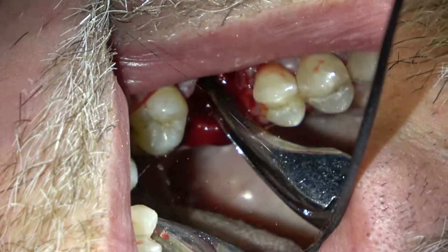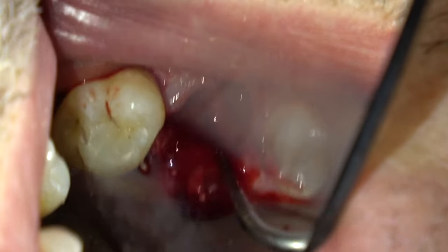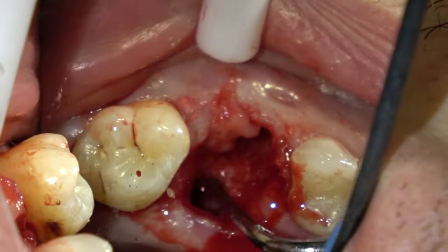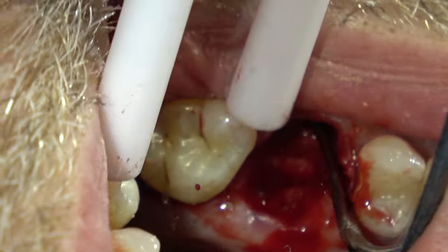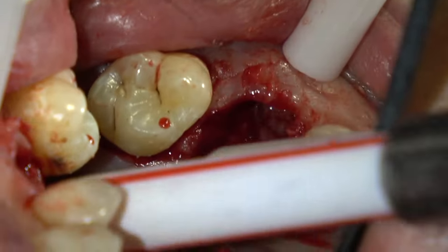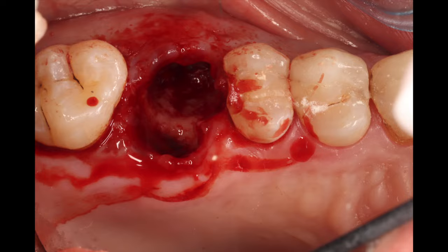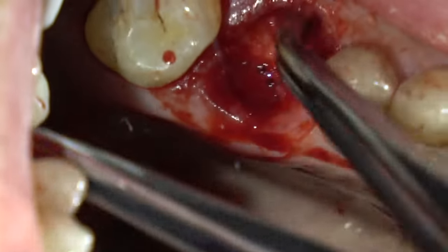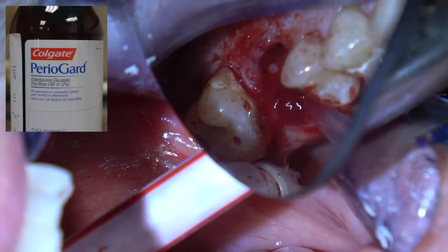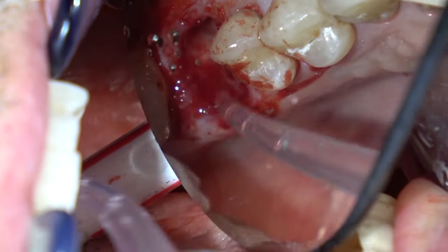There's a lot of granulation tissue in here because we had an infected tooth. I'm going to remove as much as I can with the rongeurs and come back with a large spoon curette to scrape the granulation tissue out of those sockets. If the roots of the tooth are into the sinus, you've got to be mindful of the sinus when curating. In this case there's solid bone on the apices of each root, so I can curette without regard to the sinus. Then I'm going to scrub it with chlorhexidine on a cotton ball and irrigate with chlorhexidine in a syringe so the floor of the socket is perfectly clean.